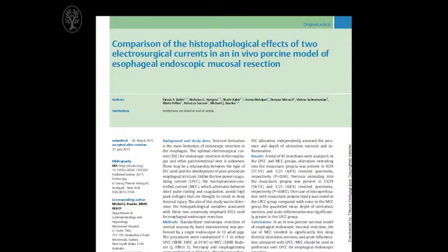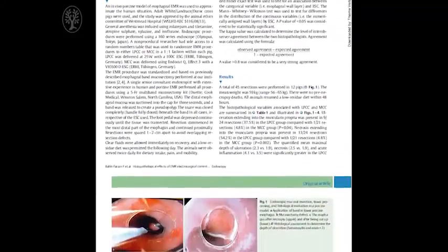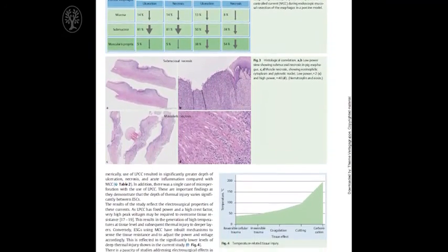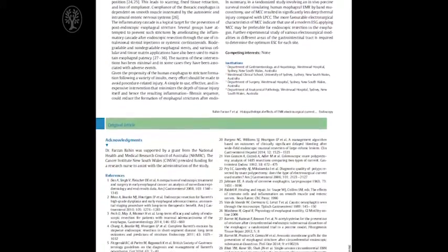I refer to the article for several electrophysiological principles which are imperative to the understanding of the different types of electrosurgical currents. And in brief, as the amount of coagulation and carbonization increases, the heat in the tissues is increased, and therefore the relative risk of transmural injury and subsequent scarring possibly may be increased.